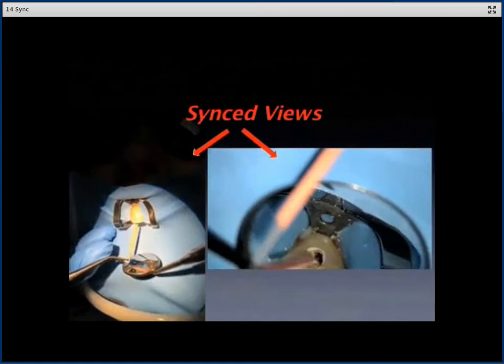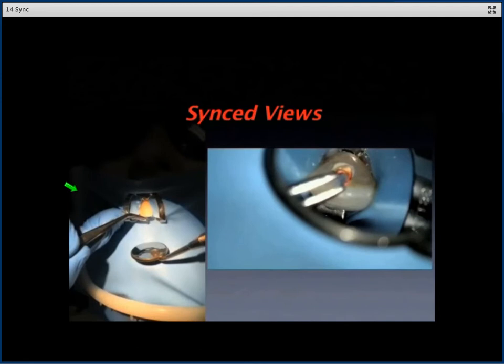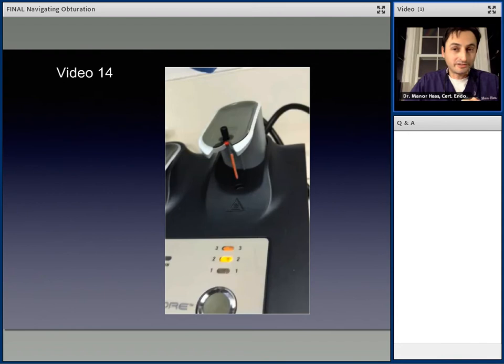So there's the warm obturation tip that we have. I'm placing it inside the canal over here. I'm counting 5,000, 6,000, 7,000. That's it. That's the key. On the right side, you see the view through my microscope. Believe it or not, we'll go back to the slides. Believe it or not, the only catch in this case was, can you put that in there within 7 seconds approximately? It sounds so simple, that's all it takes.